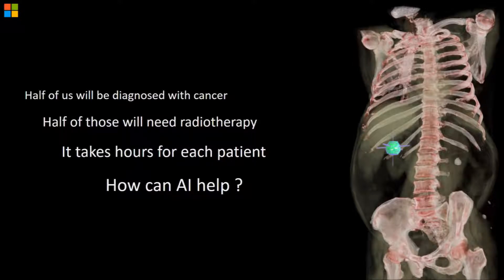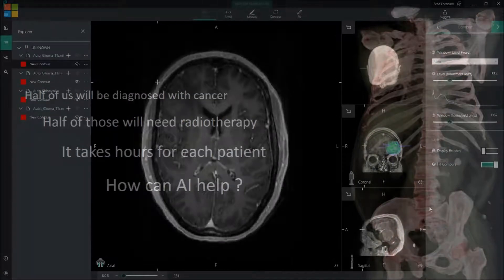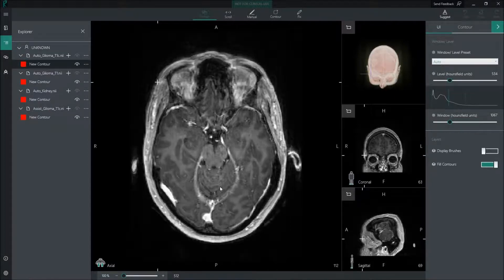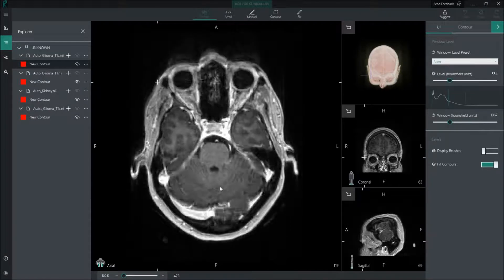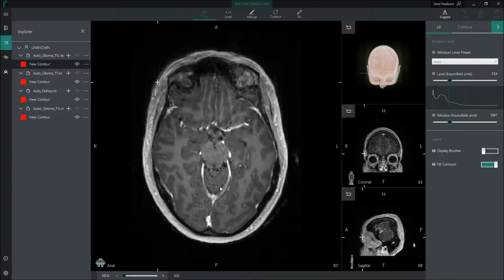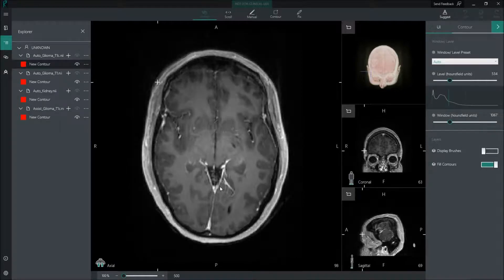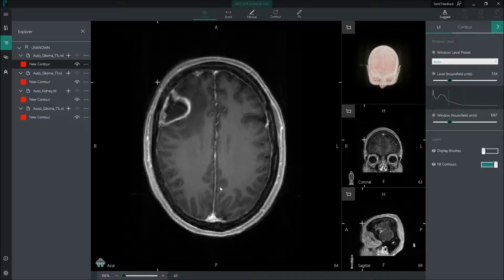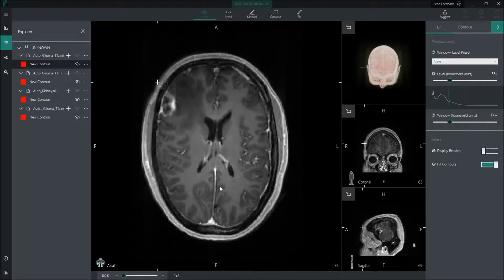Thank you very much Raj, and hello everybody. My name is Antonio Criminisi and I'm a researcher at Microsoft in Cambridge. You're looking at a typical MR scan of a patient's brain. This is a three-dimensional magnetic resonance image and we're looking at it through multiple horizontal cross-sections. Sadly, this patient has been diagnosed with a rare and aggressive form of brain tumour called the glioblastoma, which you can see here.